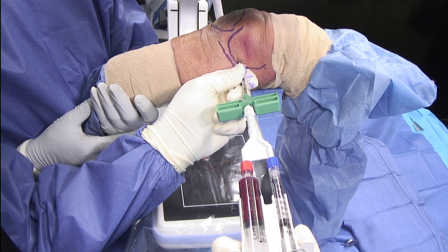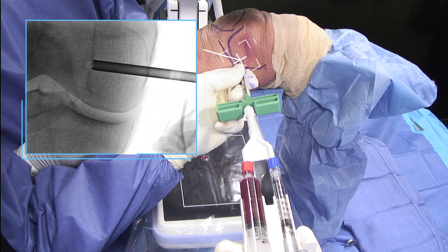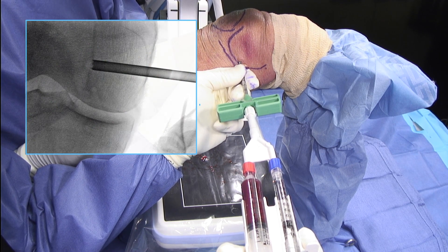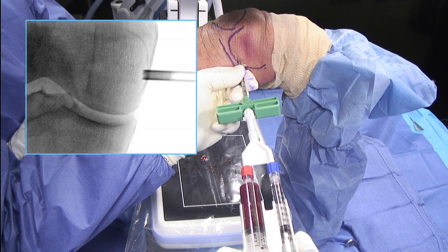I will then begin to inject the mixture. While I'm injecting, I'm slowly going to be removing and backing out my delivery cannula under fluoroscopy to ensure that I have full fill of the lesion.